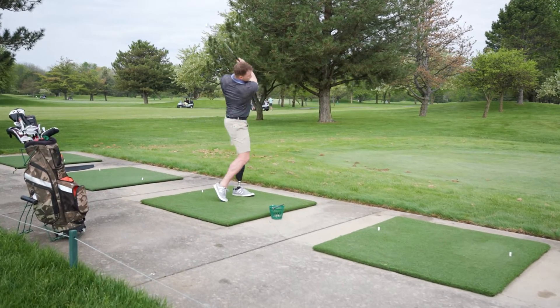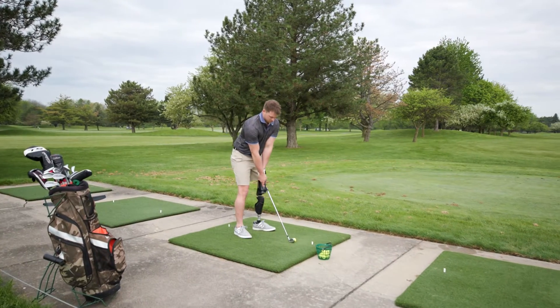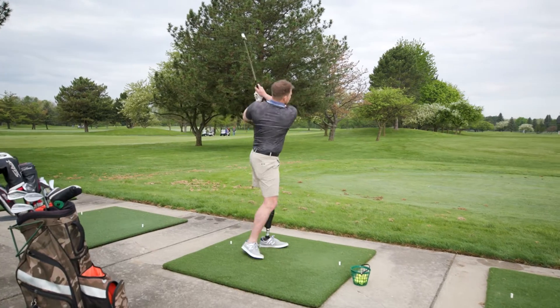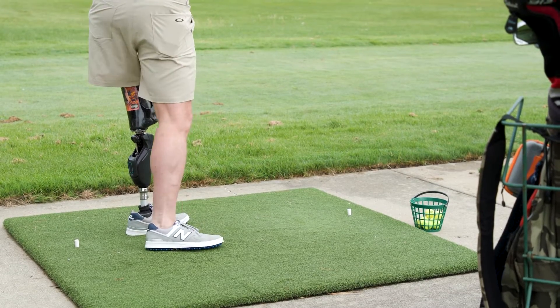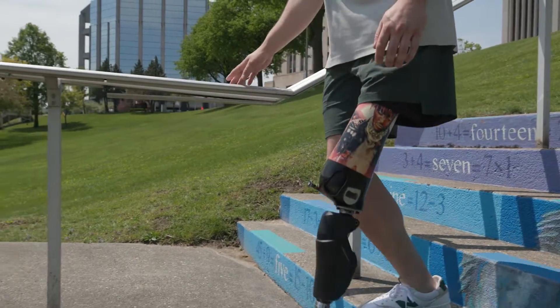Being able to lock the knee in certain flexion angles, and knowing when you swing through you've got to transfer your weight from your back leg to your front leg, and being able to trust that the knee is not going to bend — not having to think about the knee being there for my next step, and knowing it's always going to be there, is fantastic.